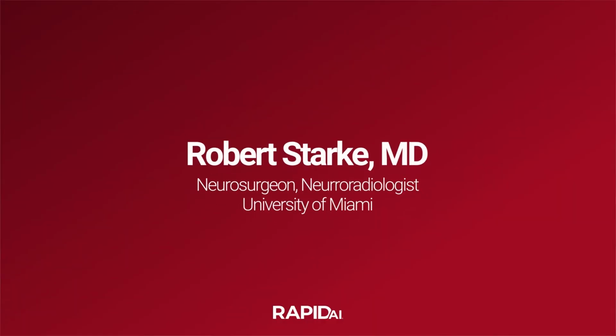This is an 80-year-old. She's got a history of 14 aneurysms. She presented more than 20 years ago with a subarachnoid hemorrhage and had clipping of 2 MCA aneurysms and a PCOM by one of my partners. She had intermittently been lost to follow-up, but then in 2013 was noted to have one of the very large aneurysms of the ICA segment growing. They attempted to treat that, and due to significant tortuosity, it was aborted and again, she was lost to follow-up.